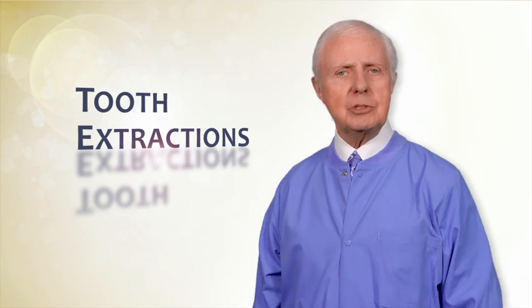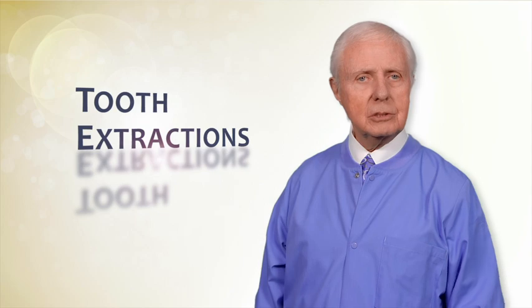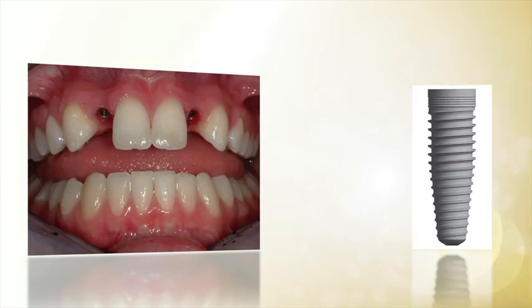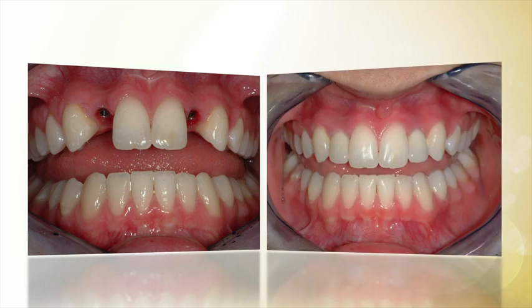Among the restorative procedures are dental implants with crowns on them, fixed bridges attached to remaining teeth, or removable partial or complete dentures. This patient has had 2 dental implants placed in the areas of the missing teeth and crowns placed on the implants for an excellent restoration.